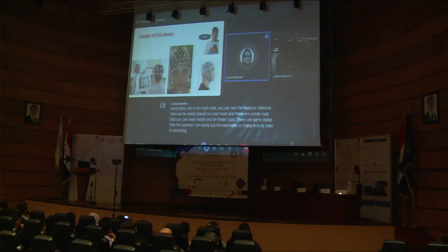Some of these headsets are used, for example, for sleep studies, sleep disorders, or some of them are usually used for neuromarketing fields of studies. You should be careful that studies show that the quality of the signals of these headsets is lower than the clinical versions. And in clinics, usually they avoid using headsets when they need a higher level of accuracy for their diagnosis. But in studies and in research projects, we usually use the headsets because of their ease of use.